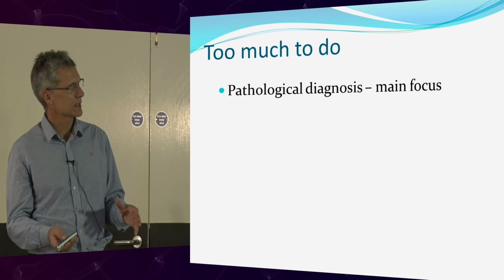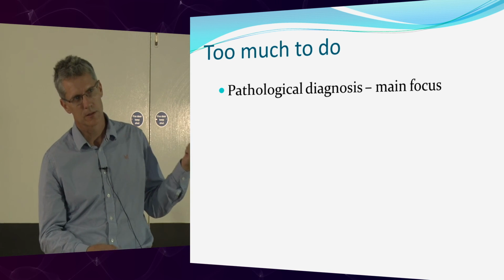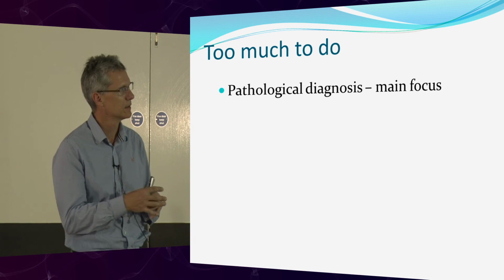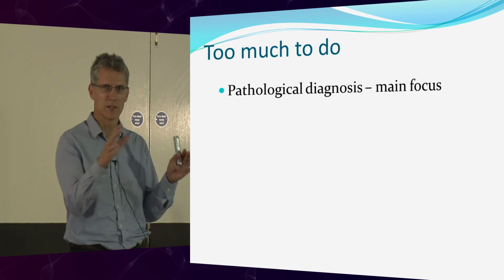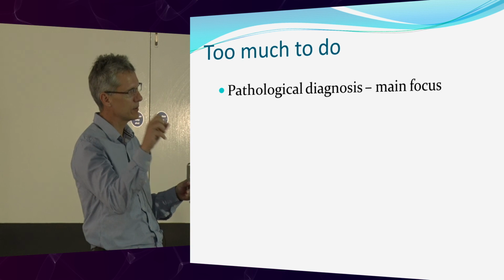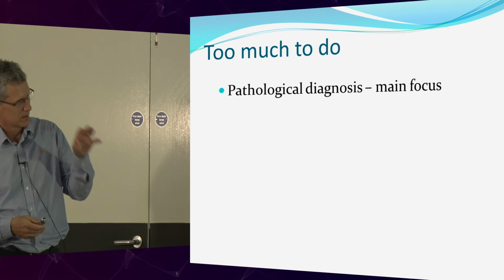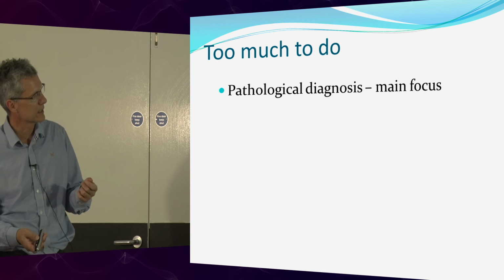So main diagnosis has to be pathology. And I think one of the first slides I put up, so the work of the muscles against the elastic recoil of chest wall and lungs, and then the resistance. You've always got to look at that equation and say, right, have I got a pneumonia? Are the lungs stiff? Have I got pulmonary edema? The lungs are stiff. Just try and work out where along there the problems are, fix that, and then you can fiddle with the ventilator.